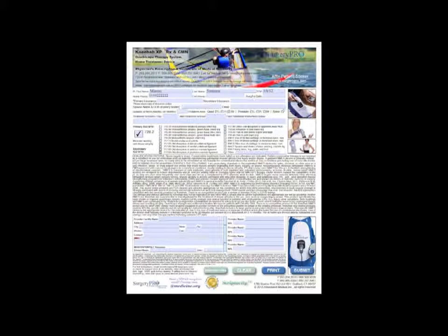Now, nothing is selected here, so note that you've got to select either left quad, right quad, or bilateral, which would basically be one controller and 2 garments. I've got a left shoulder, right shoulder, bilateral shoulder, and spine. And again, I can click to select, click to deselect, or I can use my tab key.